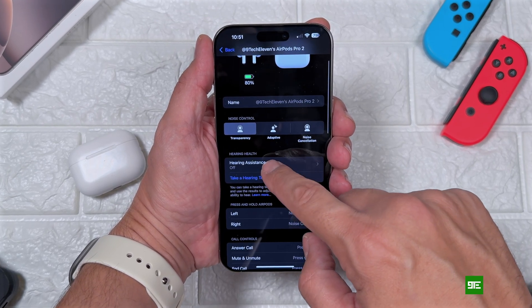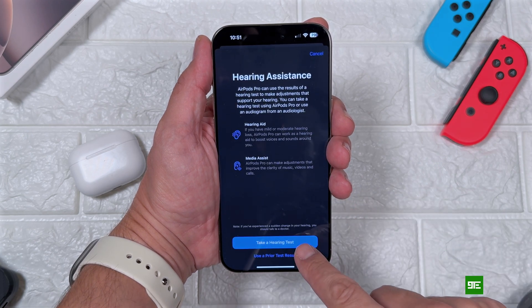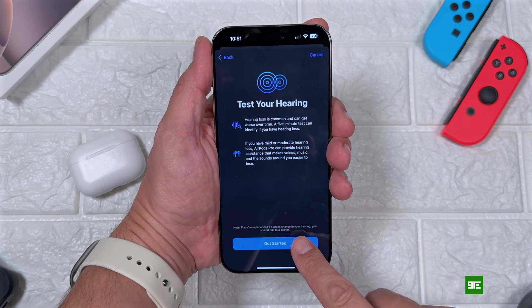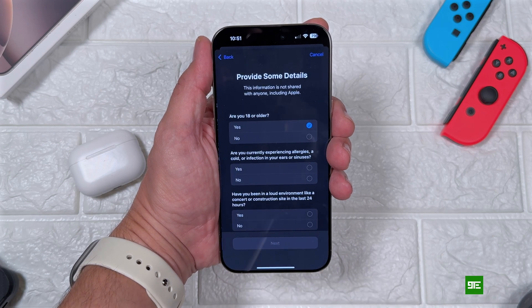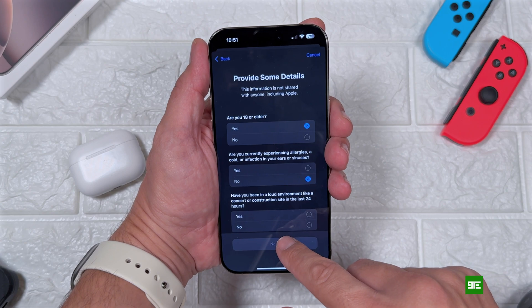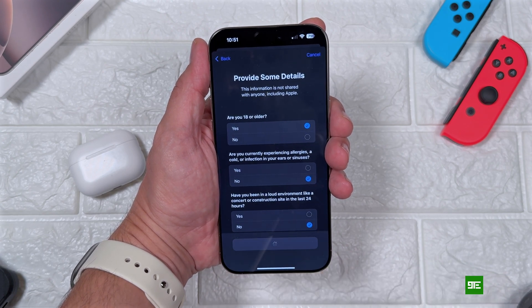First, wear your AirPods Pro 2 and search for hearing assistants in your AirPods settings. Choose 'Take a Hearing Test,' hit 'Get Started,' make the necessary selections, then hit next so that we can get the test starting.